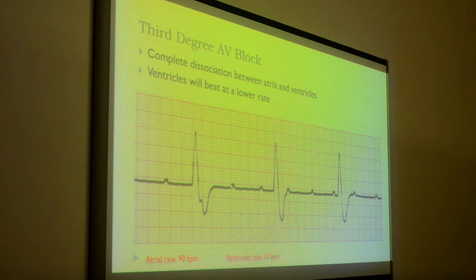One small question. There's one T wave there, right? Okay, the T wave is difficult. It's not really a T wave. This might be some repolarization happening here. But I think actually this is more of an educational, drawn ECG. But there could be repolarization happening here, yes.